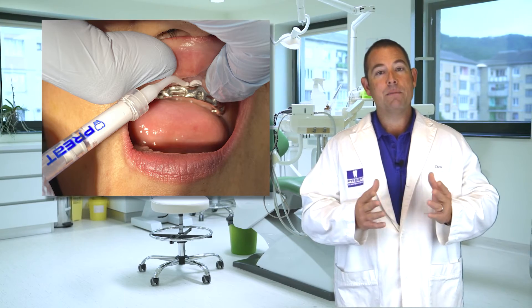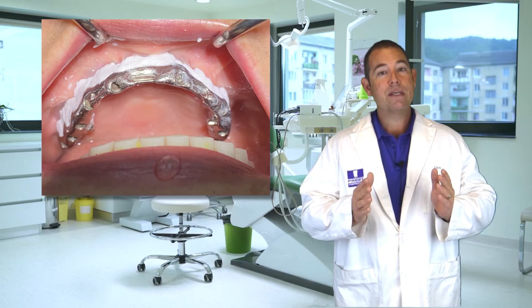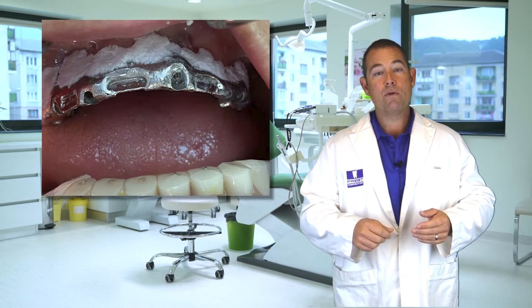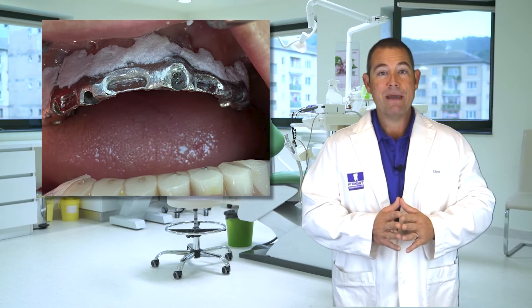As you can see here, Permablock was used to block out. It was easy to use, stayed in place, and after the blockout, it's easy to just poke away with the tool, pick up most of the big pieces, and then suction up the rest.